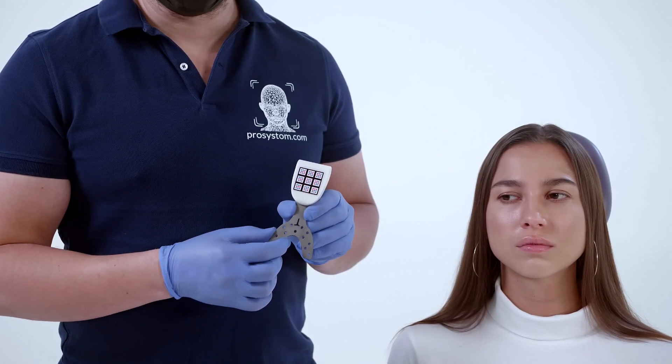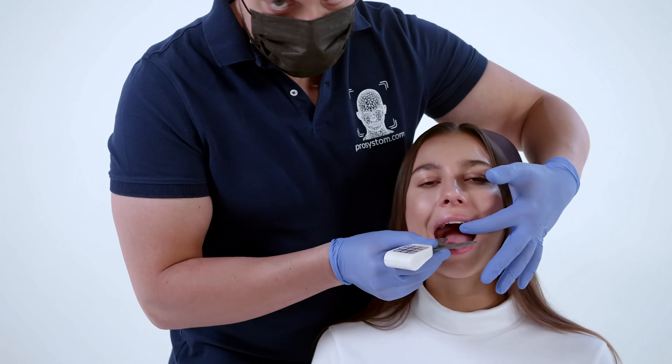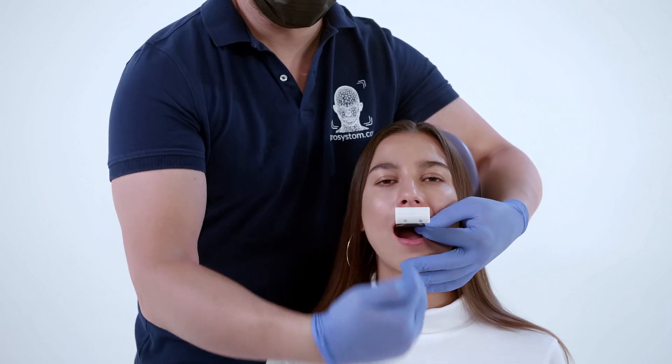This area of the bite fork is usually not covered by the register, in order to better see how the fork is positioned against the teeth. The fork is positioned according to facial features and aligned along the vertical aesthetic line of the face.